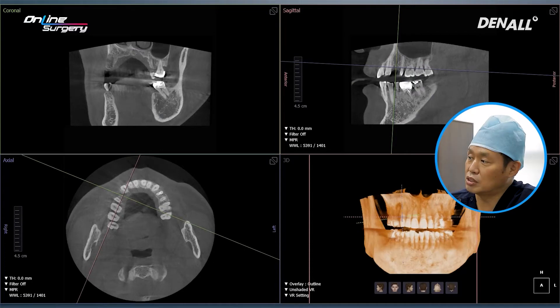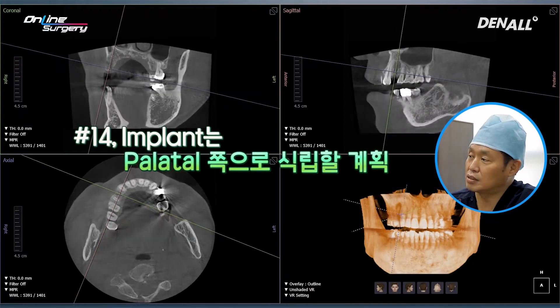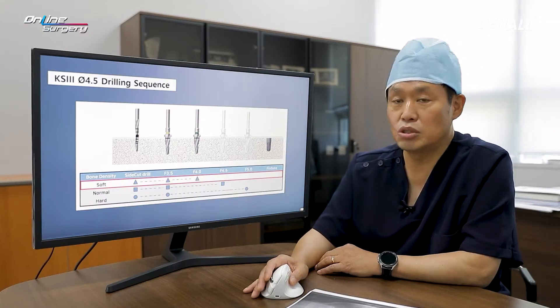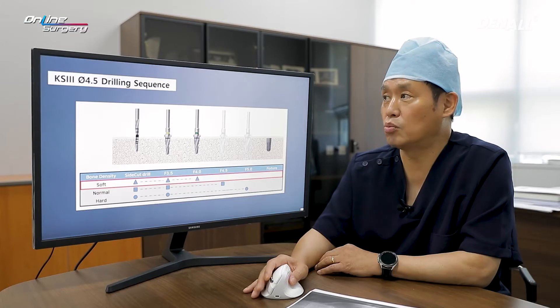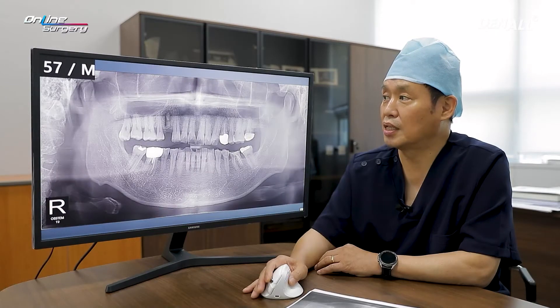It's an upper premolar, so I'm going to place the implant slightly palatally. I plan to place K3. Because it is a premolar, the diameter is going to be 4.5 by 10 mm. It has been approximately 6 months since extraction, so I anticipated the bone to be soft and final drilling is going to be done up until 4.0. There will be no major issue in placing a 4.5 KS3 implant.